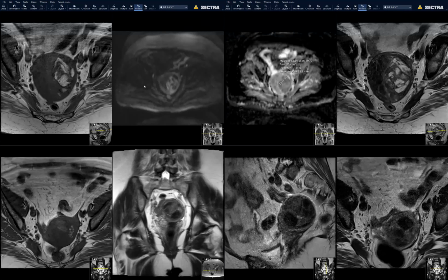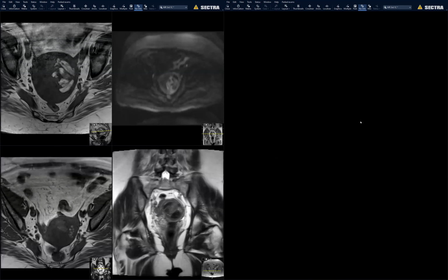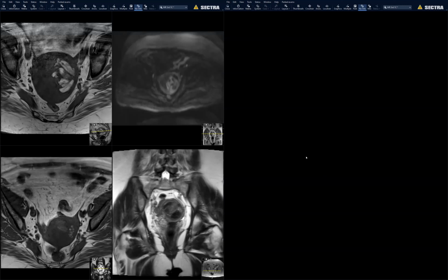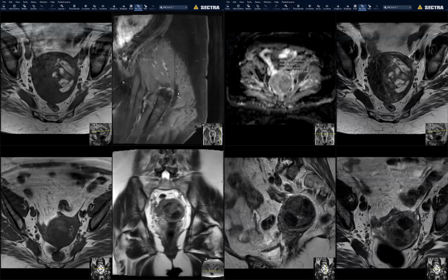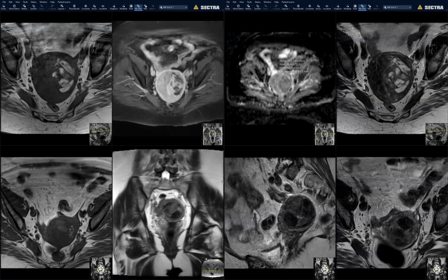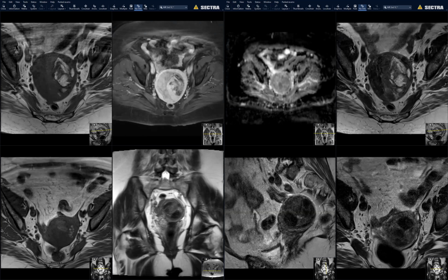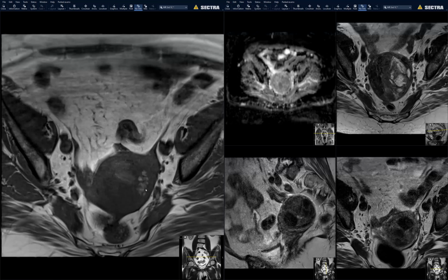Okay. But there's one more thing, the reason for showing this. So it's got blood in it. It's fat. So this actually turned out to be a path-proven lipoleiomyoma. Cool. Wait, show me the fat set. There you go. Very cool. But okay, if the fat is in it, you would really not think it's a leiomyosarcoma, right? No, we were not thinking that. I just wanted to show it. It was because it had become a lot more heterogeneous and larger. So even in the old scan, you can see fat.